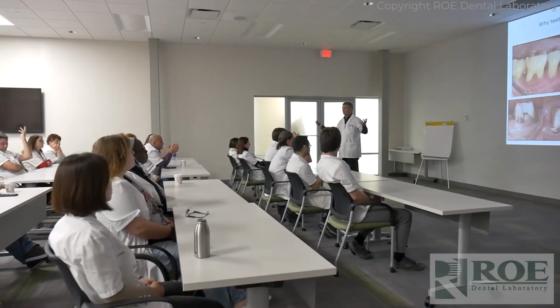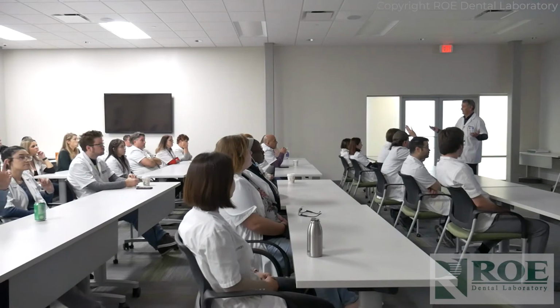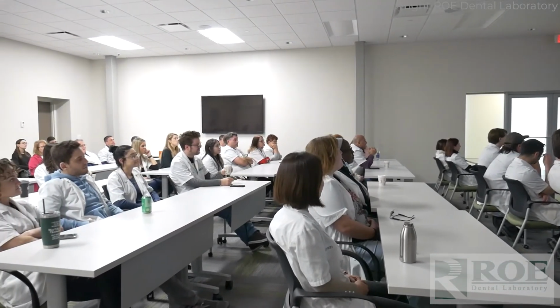Thank you. So Dr. Zabell, I know we talked a little bit about the proper contour on these crowns. Why did we hit home so much today with the technicians about that buccal contour, that furcation that's created on the buccal contour, and having that prepped correctly, and why we have to maintain that all the way through to the occlusal? We don't have to make a perfect crown. We have to keep the contours of the furcation. Why do you think that was such an important thing that we had to hit home with these technicians?